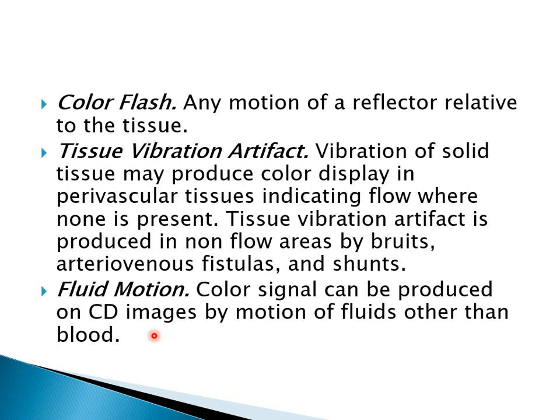Okay? If you move your hand, color flash will happen. Everything will light up like a flash. If you have something that makes the tissue vibrate, like a bruit, you will have artifact. If the gain is too low, you will miss blood flow. If the gain is too high, everything will be noisy and everything will take color. So you need everything to be in good settings.